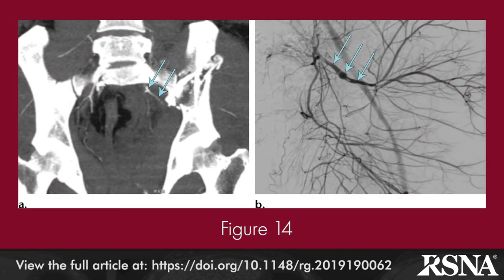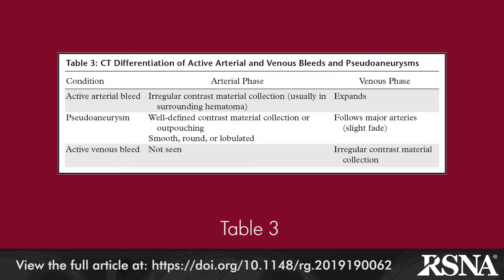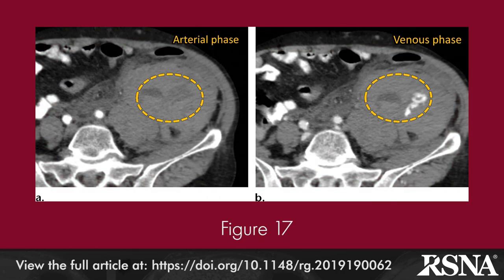Indirect or soft signs of vascular injury on CT include loss of clear perivascular fat planes, perivascular hematoma, or hematoma in the vascular territory. Figures 14 through 16 illustrate the various findings. In Figure 14, arterial wall irregularity on CT correlates with angiographic findings of arterial dissection. Table 3 provides a summary of CT differentiation of active arterial bleeding, active venous bleeding, and pseudoaneurysm formation. An active venous bleed is characterized by extravasation of contrast on venous phase imaging, which is not present on arterial phase scans, as shown in Figure 17.